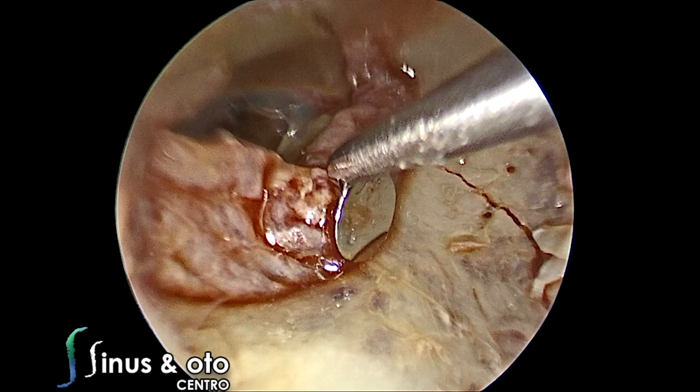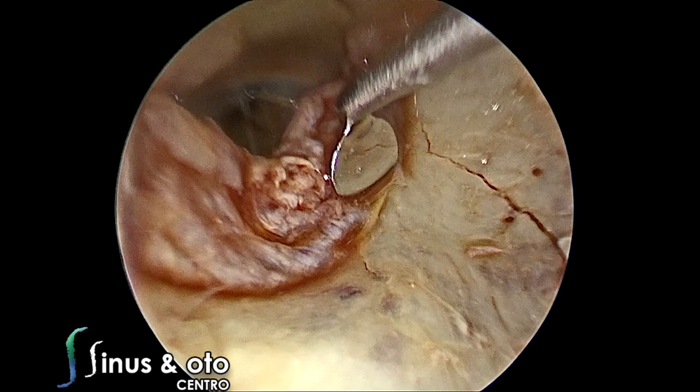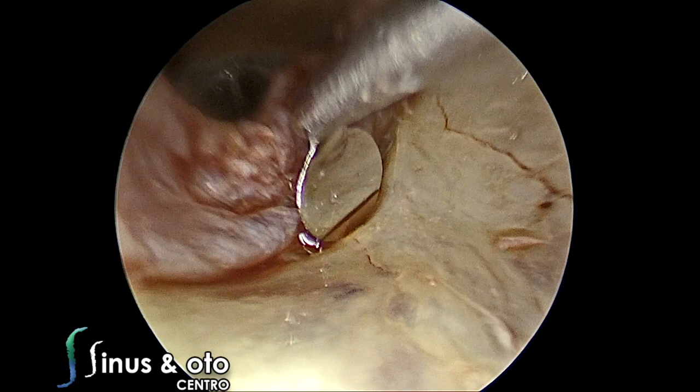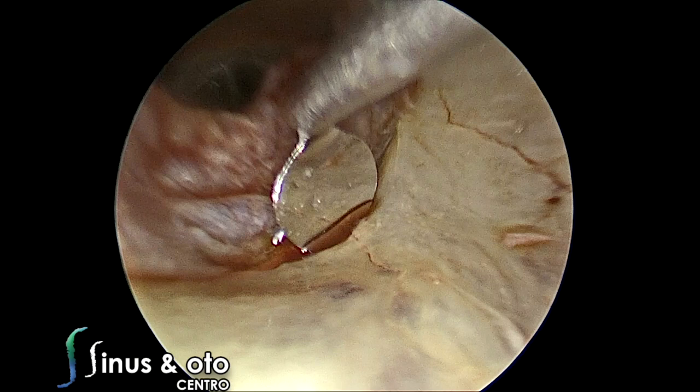During surgery, raising the tympanomeatal flap is probably the most difficult step of the procedure, because it's the surgical time that it bleeds. There is probably a temporal bone fracture in this specimen. We see the tympanic annulus at the pars tensa of the tympanic membrane, and we elevate this annulus from its canal to show the middle ear mucosa and enter the middle ear space. You can use a round knife or an elevator.